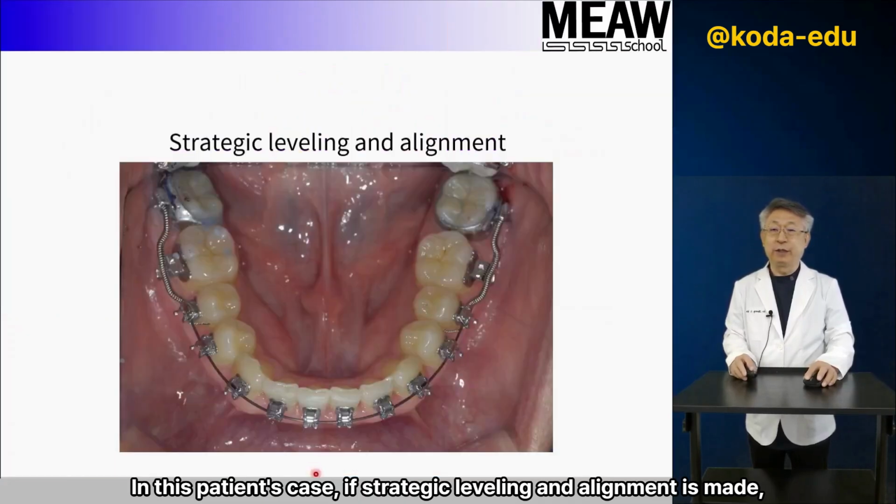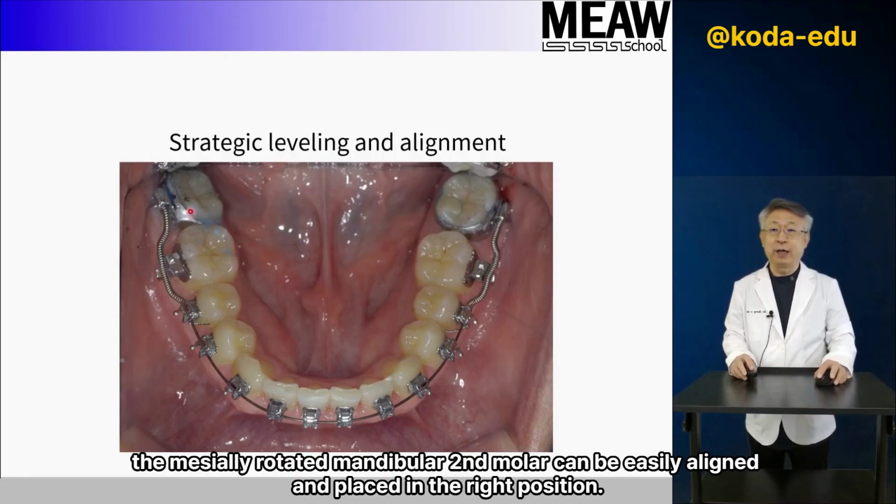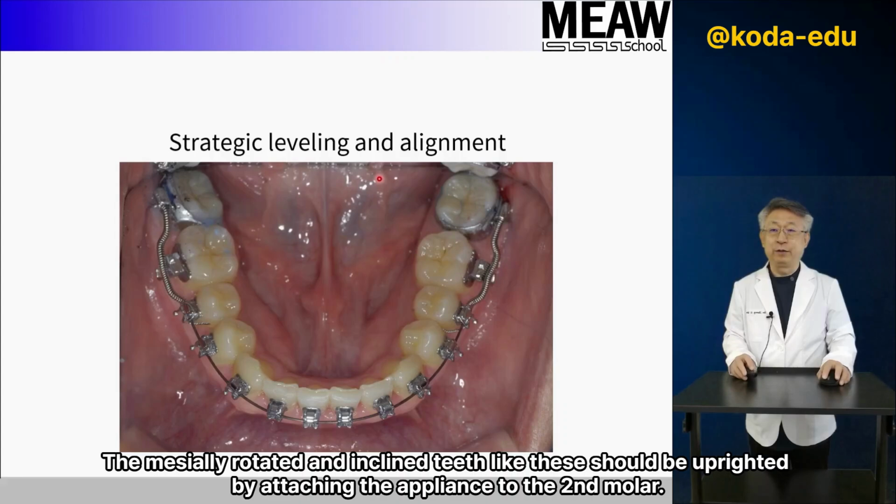In this patient's case, if strategic leveling and alignment is made, the mesially rotated mandibular second molar can be easily aligned and placed in the right position. The mesially rotated and inclined teeth like these should be uprighted by attaching the appliance to the second molar.